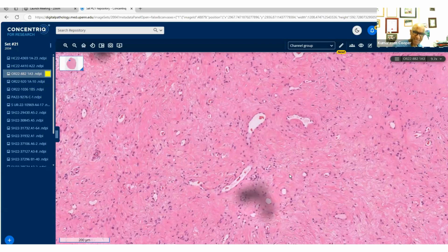And the reason that I put this in is because of the small capillary size vessels, they're hyalinized. The spindle cells are very bland. They're CD34 positive. These are also RB1 lost. Your differential diagnosis would be a myofibroblastoma, except the actin and desmin are negative here. In the myofibroblastoma, desmin's positive, so is CD34, and then ER is positive. These also have variable ER positivity, and that was positive in this, even though he's a male.